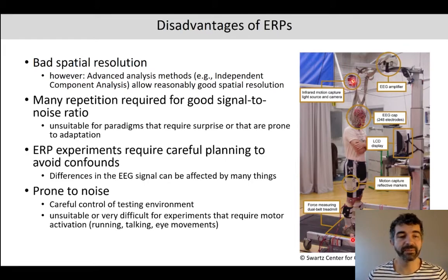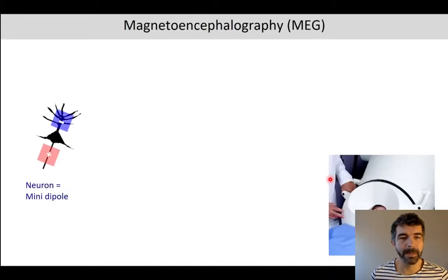That means, first of all, you're sweating, so that might be a problem for these drifting electrodes that we've talked about. But also there's just a general noise due to the movement of the electrodes and the cables as well. But as you can see, people do try it, and people do try to cope with the noise that is induced by such conditions. So it's a problem, but there are also approaches to address this.